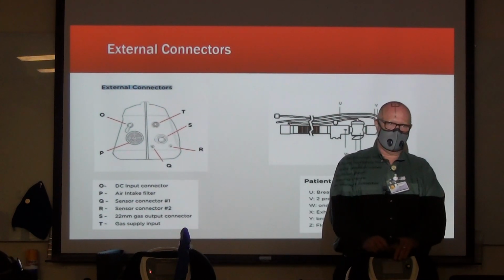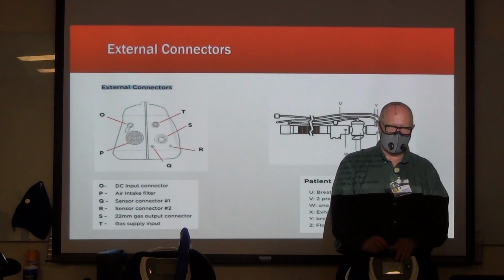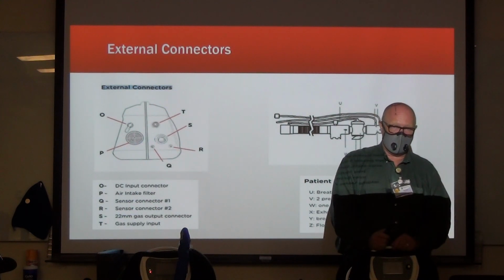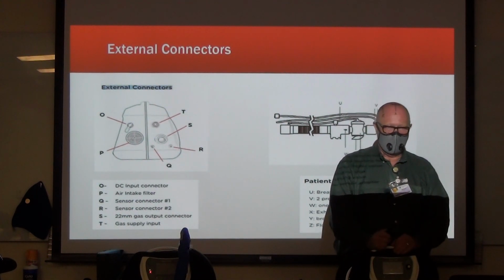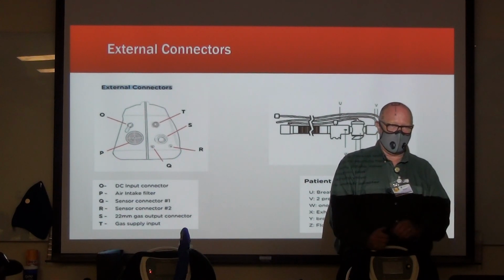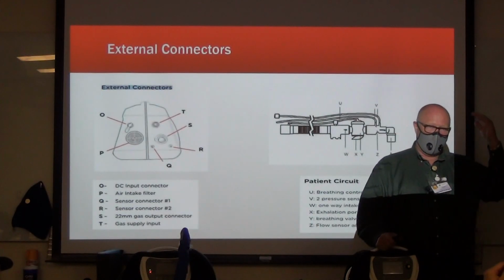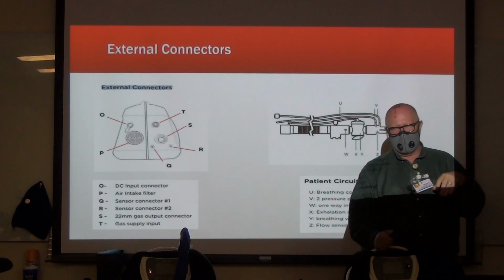Yeah, you'll need those, because that's what you'll be able to screw into your high pressure to go into the truck or a facility. What you should be doing is put it in the wall and hook your patient up while they're still in their bed, and testing based off of what we're going to see in a little bit, what your mode and all your values are.